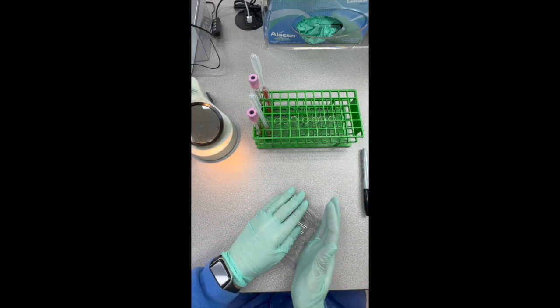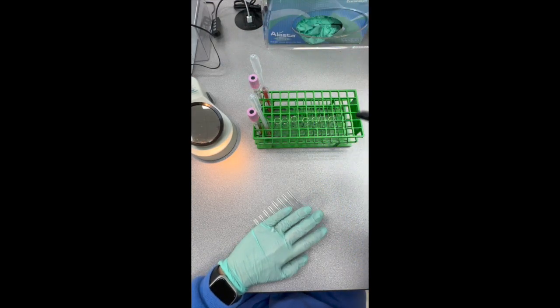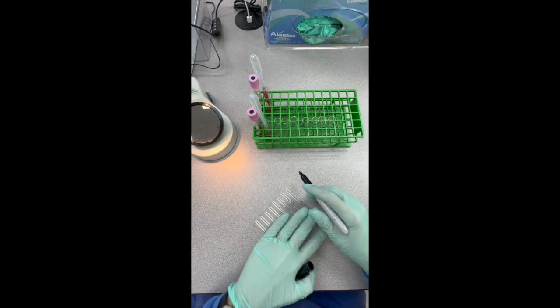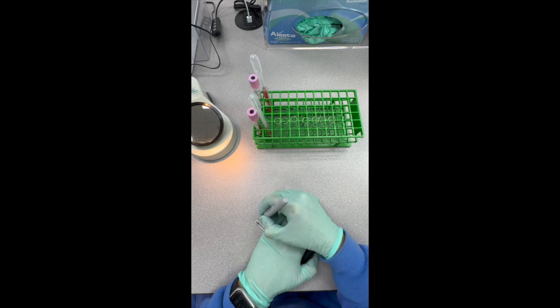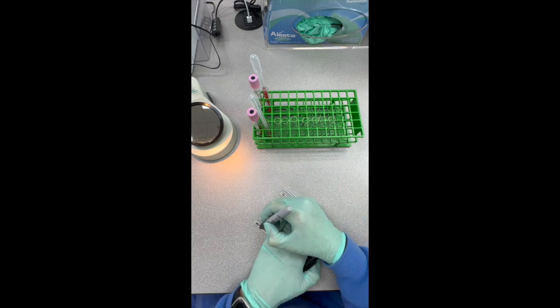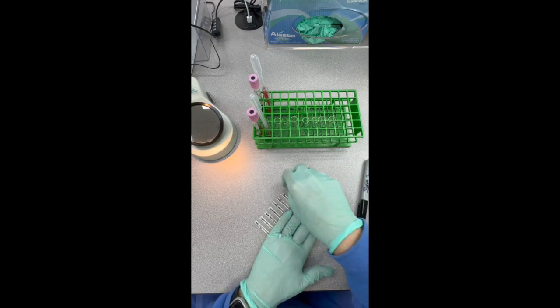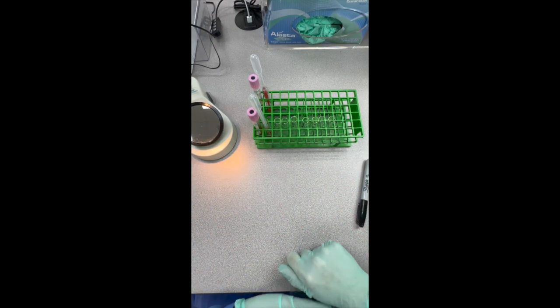Tubes here. Capital A, capital B, capital D, C for our RH control, A1, lowercase b, patient. I'm going to put C's to designate this one.